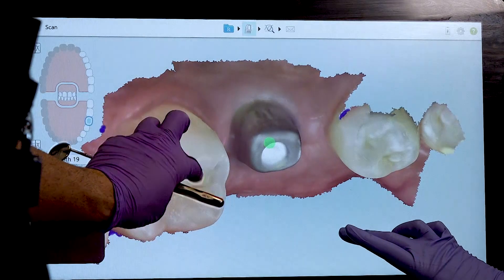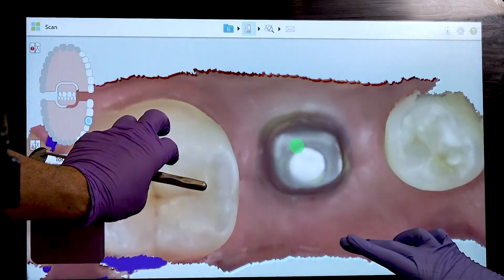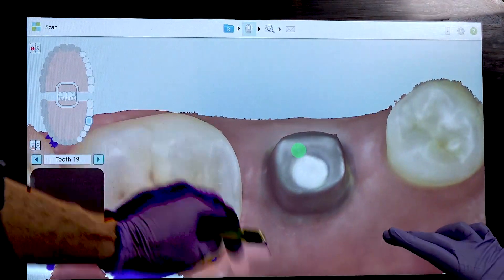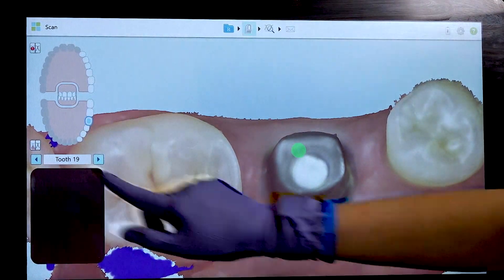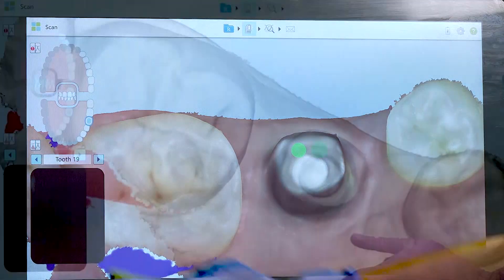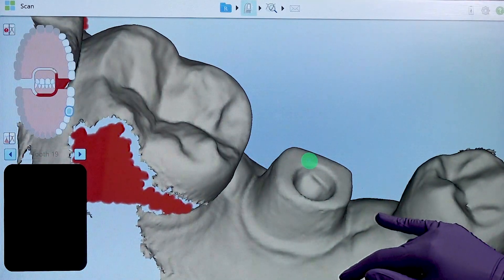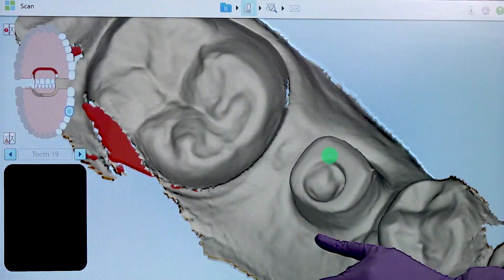In the first acquisition, we tried scanning the abutment without gingival retraction. As you can see, it is hard to visualize the margin all the way around the abutment.